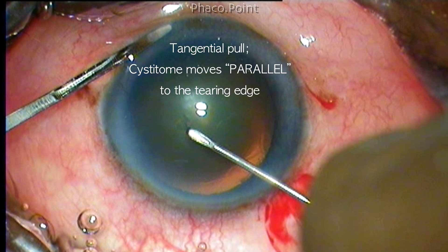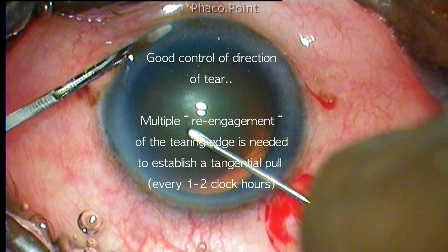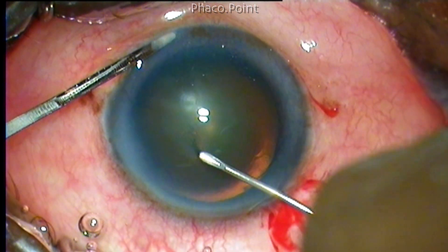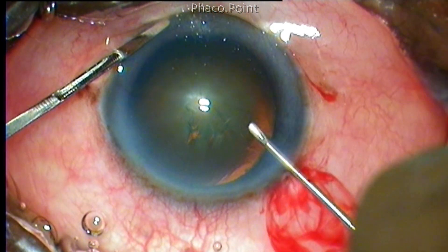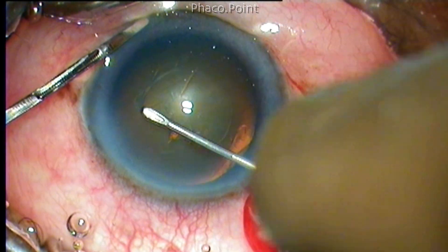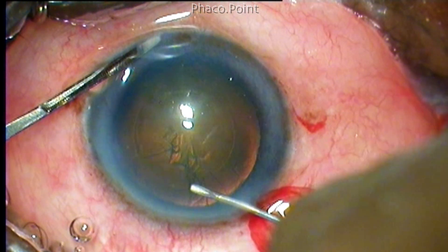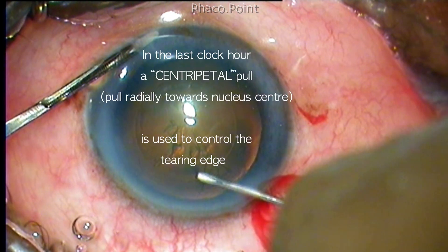When we do a tangential pull, the cystotome moves parallel to the tearing edge. This gives good control of the direction of tear; however, we need to re-engage the anterior tearing capsule multiple times to establish a good tangential pull — every one to two clock hours. In the last clock hour, the surgeon uses a centripetal pull to complete the capsulorhexis.